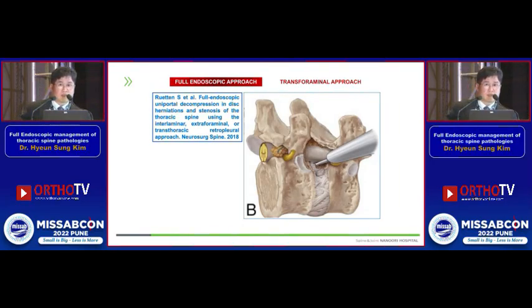In the thoracic disc extraforaminal approach, the most important key is sufficient decompression of the transforaminal space to expose the target, as in these images, and to safely approach the target point. It may need foraminotomy and resection of the superior articular process. Sufficient drilling of these bone structures will be safer and make it easier to approach the target point.